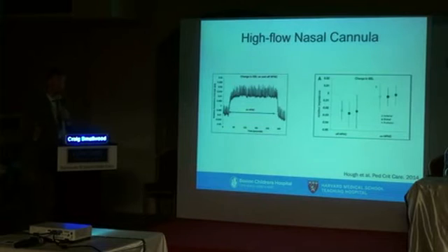So it's not just washing out dead space. It has more of a specific effect on functional residual capacity or end expiratory lung volume. And these are the statistical analyses just showing the differences in different areas of the lung. So they looked at anterior, posterior, and then the overall global differences in end expiratory lung volume by global impedance. And you can see off, lower, on, higher.